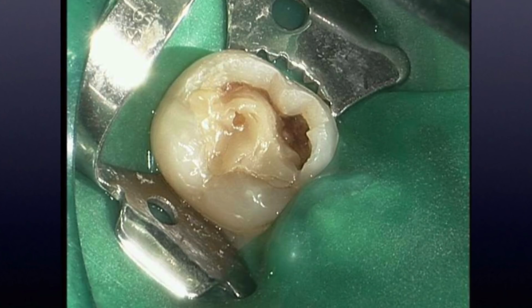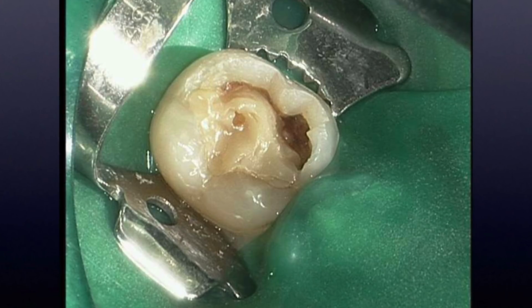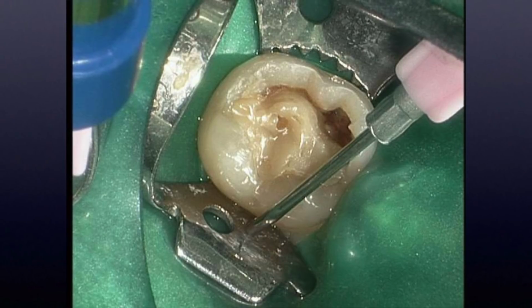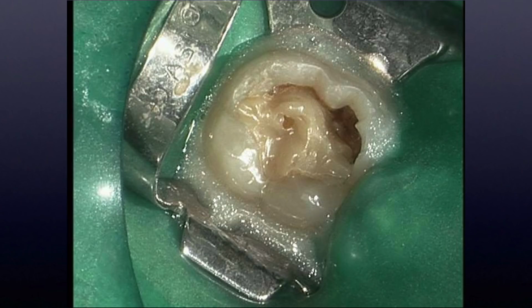Anyway, now over 20 extracted teeth that I had done to hone the technique, I went on to isolate the tooth and create primary isolation, and then do a secondary isolation, the fluid tight isolation with some caulking agent, and then removed the composite and found some decay underneath there, which was the source of the pulpitis and something that couldn't be seen originally in the radiograph.